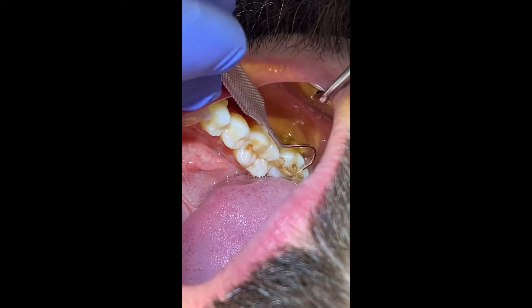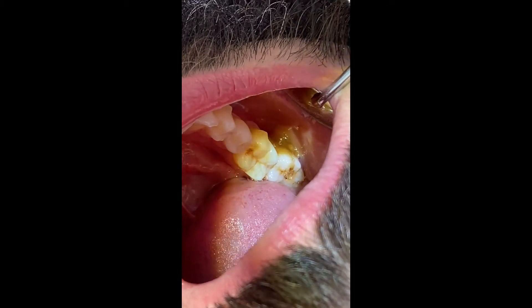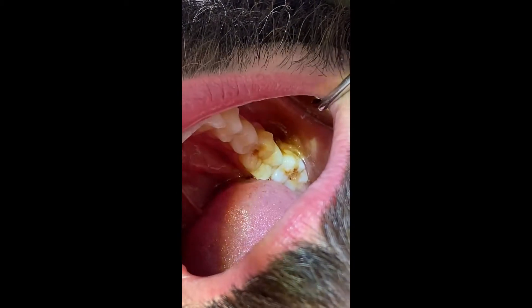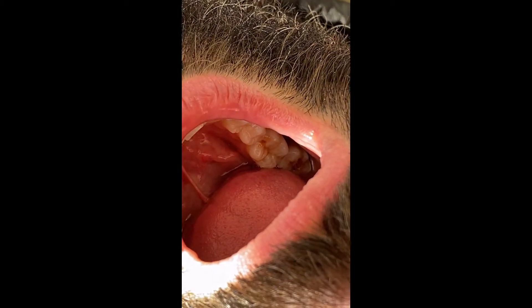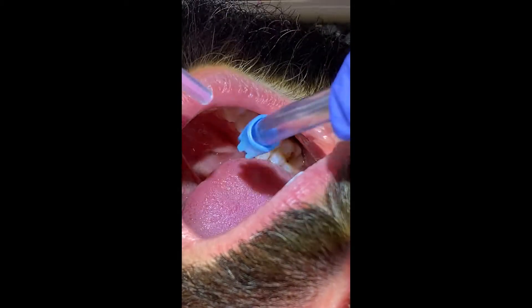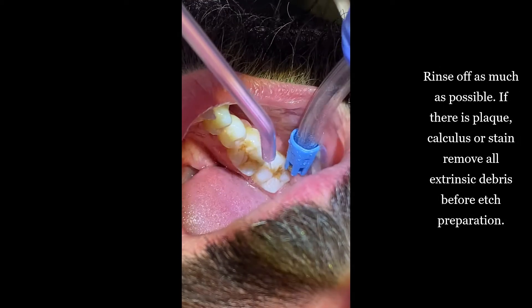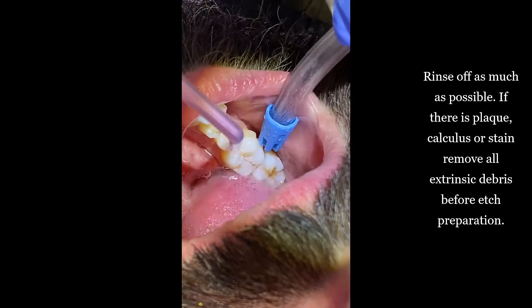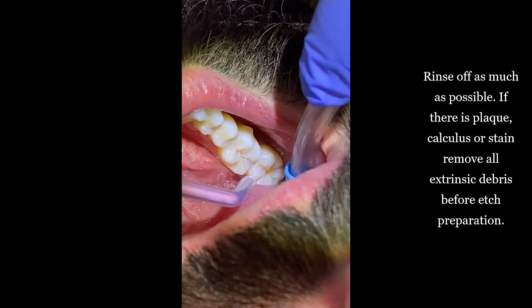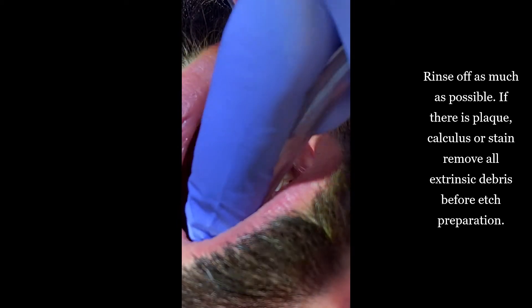The first thing we need to do is clean up these occlusal surfaces. I'm going to use a combination of water and suction to start to rinse off these buccal surfaces to see what initial debris I can remove. I'm going to grab my air water syringe and my suction, retract with my suction, and start to clean. The water and suction did a pretty good job.